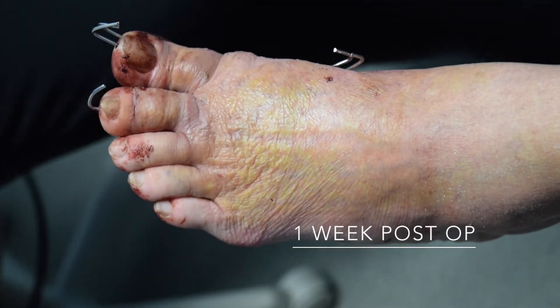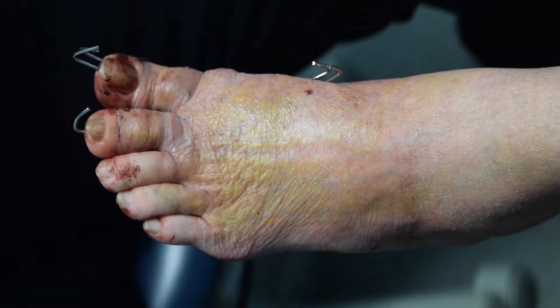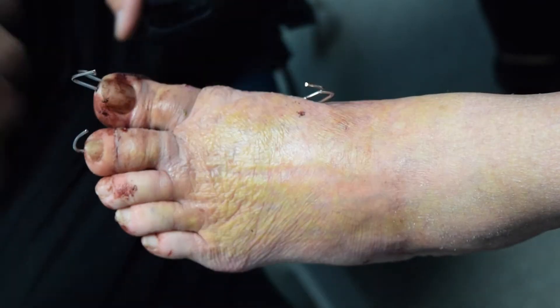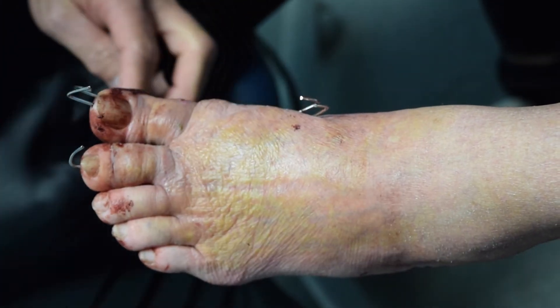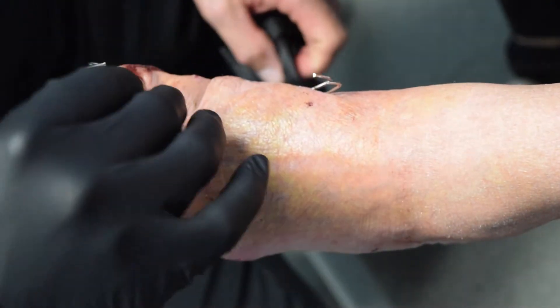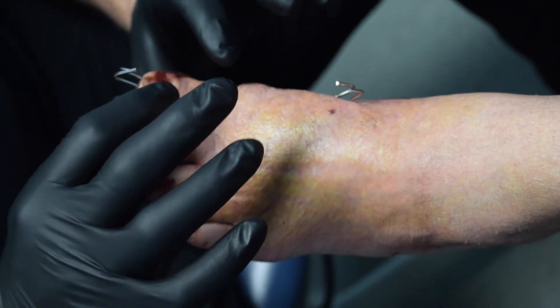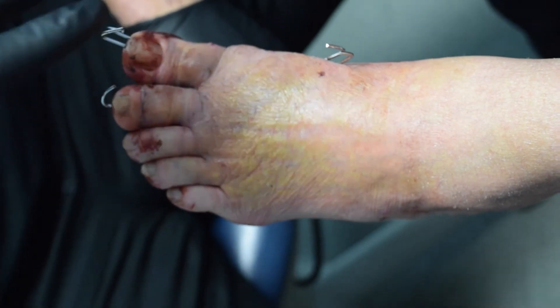Here we are at week one with the MEA procedure. You can see that our fixation is in place — the distal fixation runs into the metatarsal, into the medullary canal, and then out into our distal fragment. The proximal goes into the cortical bone, into the cortical bone, into the proximal fragment. We use two points of fixation to maintain length in the toe and allow us to varus-rotate the toe to keep it out of this valgus deformity.